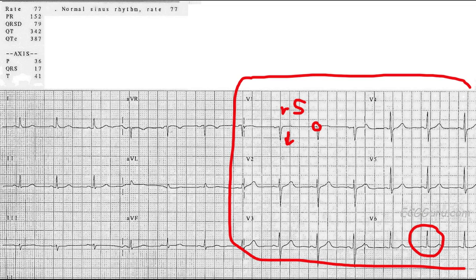What's normal is that we should see a progression from negative to positive as we go across the V leads, which are placed pretty symmetrically across the chest. The R wave should gradually get more prominent and the S wave gradually less prominent. By V3 or V4, we usually see about a half-and-half distribution of R to S. By V5, we've almost lost the S wave, and by V6, we've lost it. That is called R wave progression, and that's normal.